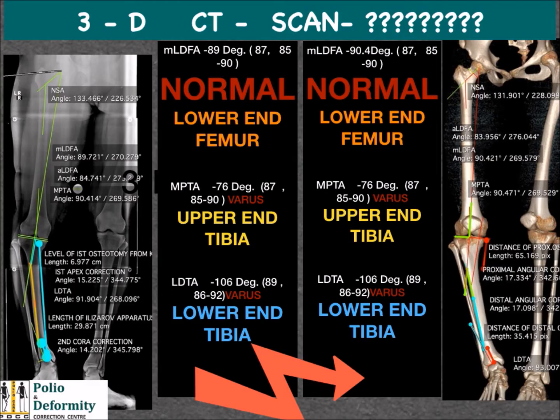So this concludes, if the patient can bring his own scanograms where it is improper, you should not rely on it for your final calibrations.